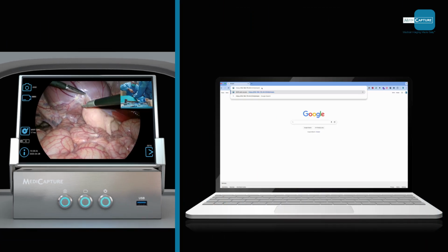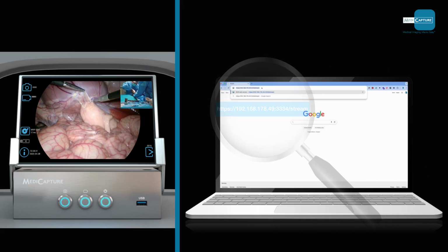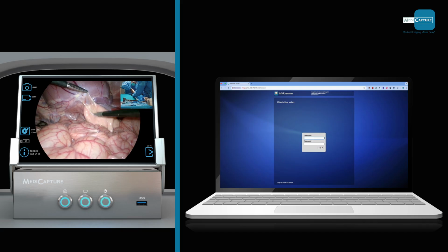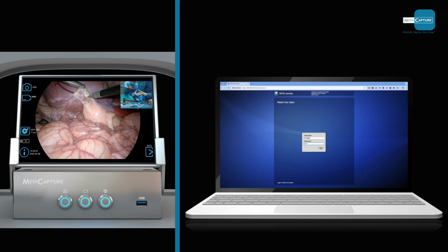On the viewer side, Dr. Miller opens Chrome and enters the stream address you provided together with the stream suffix, and this opens the login portal. He logs in with the account you created and requests access to watch the live stream.